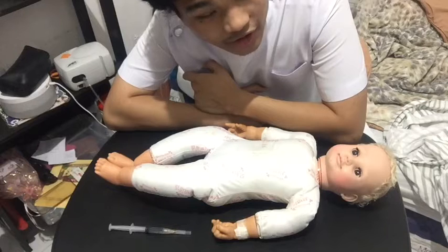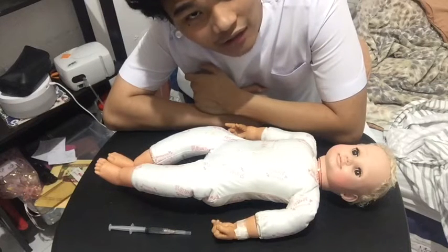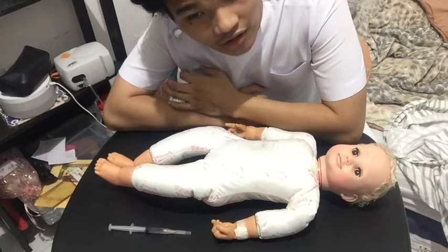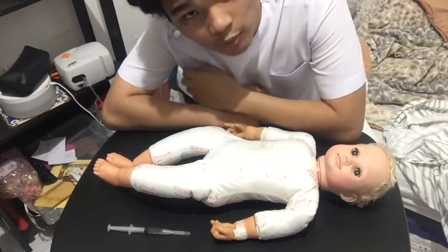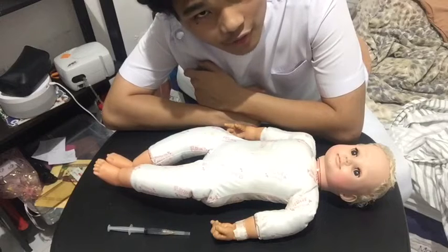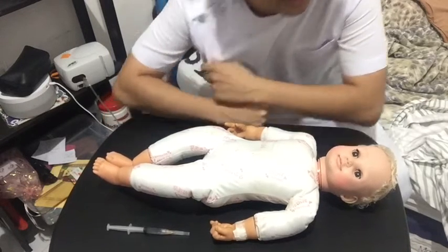Before taking another deep inhalation, you're going to have a few short, small breaths before taking another large one. That's the proper way of breathing through a nebulizer. The purpose of that is for better absorption of the medication placed in the nebulizer.